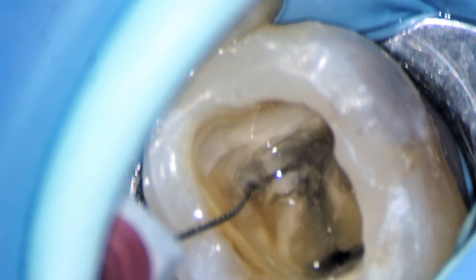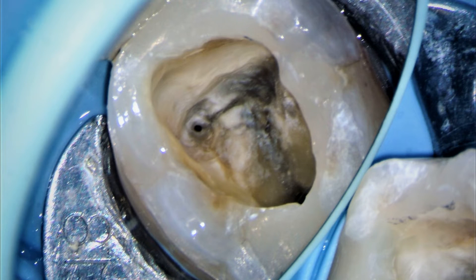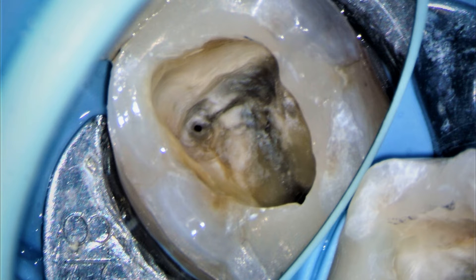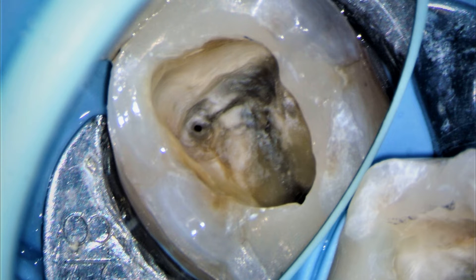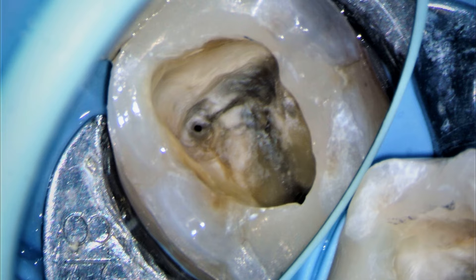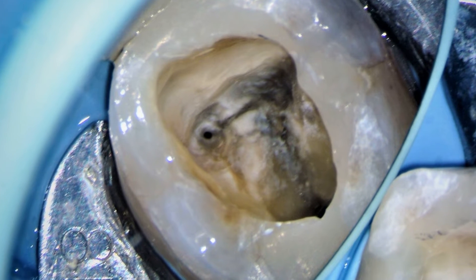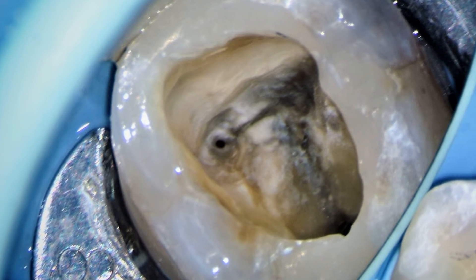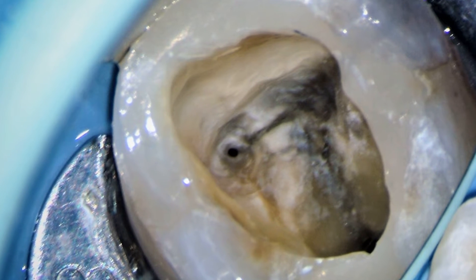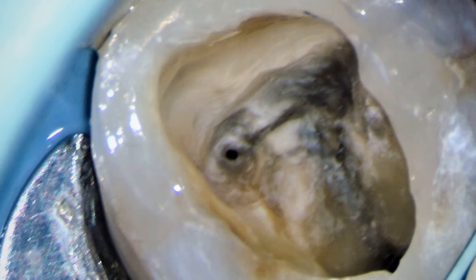This is an image after troughing by ultrasonics — we could find a catch in the mesial canals. One thing I would like to discuss here is that whenever calcification is present, the walls of the canal are dark and the white material in the center is the place where we need to trough.